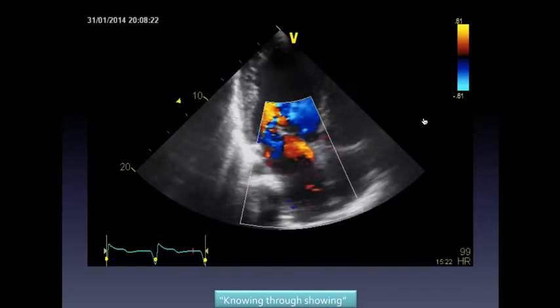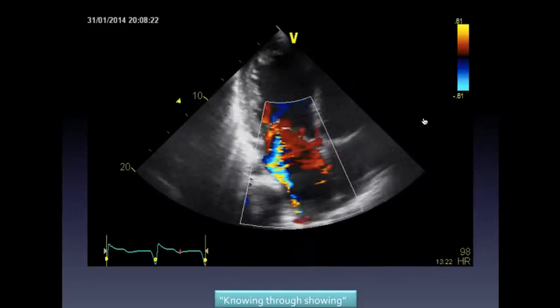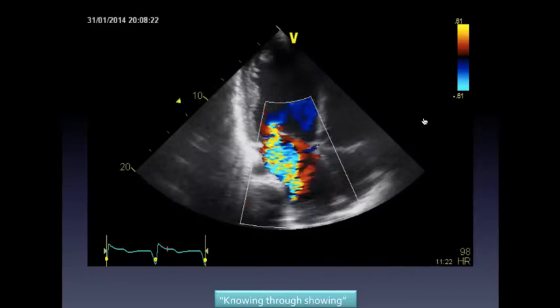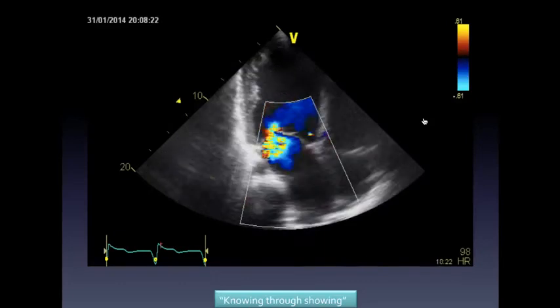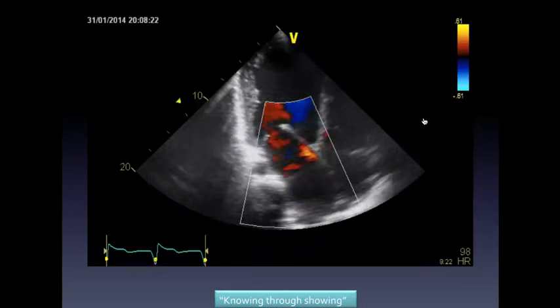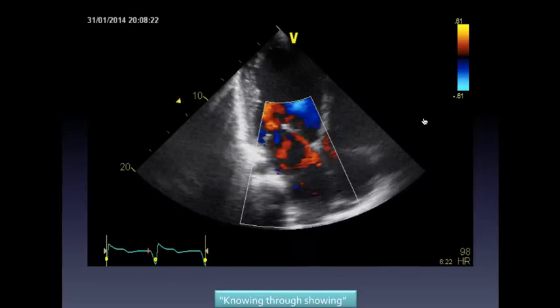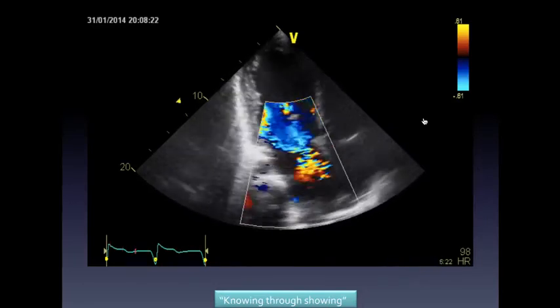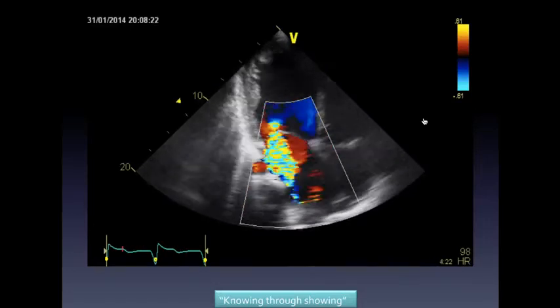So in this young gentleman's case, we had a very low cardiac output, even lower than you might have estimated by the ejection fraction, which partially contributed to a significant degree of mitral regurgitation. And this guy's management was very straightforward. We gave him an inotrope to increase his cardiac output to get him over his shocked liver. What is surprising is that his liver ultrasound showed very little congestion. Okay? One of the reasons we see abnormal liver function tests in the ill patient, particularly with low cardiac output, is back pressure through the liver. But in this young gentleman's case, it is a true case of cardiogenic shock presenting with acute shock liver and all that goes with it.